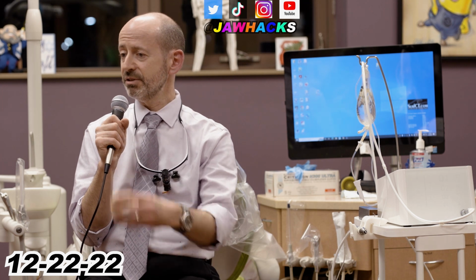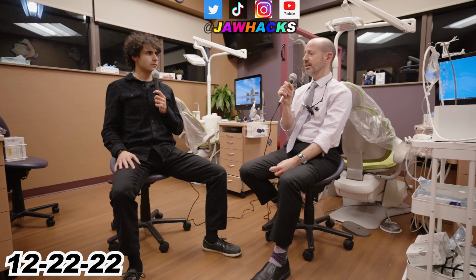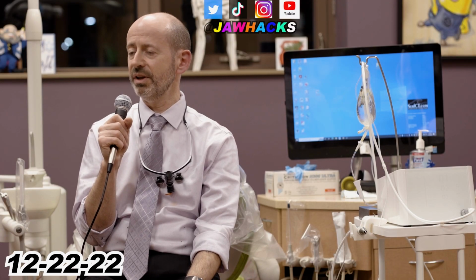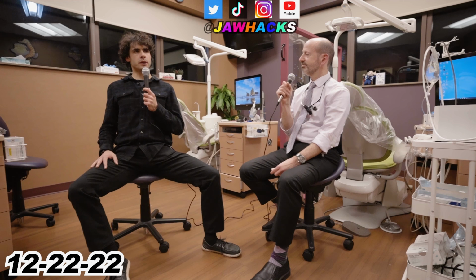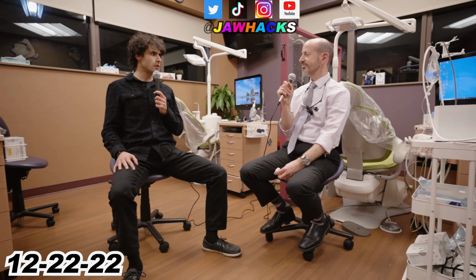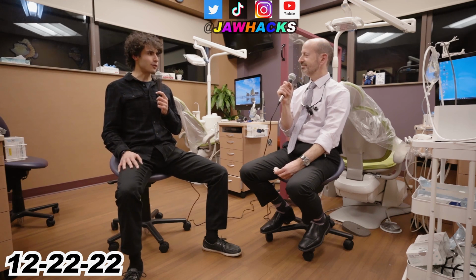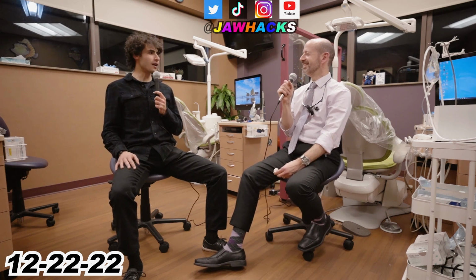Yeah, and Dr. Ting was actually probably the first one talking about a slow expansion protocol. And again, in my own hands, every time I try to do more than one or two, it fails more often than not. Sometimes I had to backtrack and start slower, and it worked the second time. So if you could give a rule of thumb for the ideal turn rate with the MSE from start to finish? Once a day. End of story. The right answer usually is an elegant one. One turn a day. Simple. Very simple. How do you screw that up? You can't. Right?